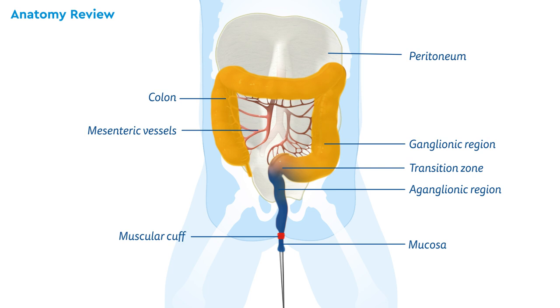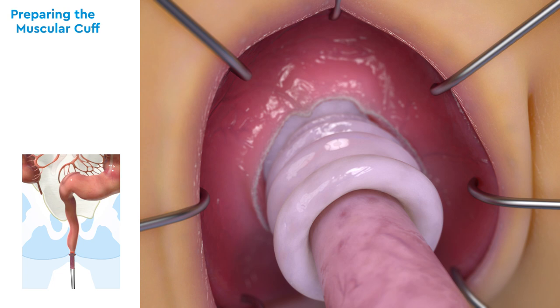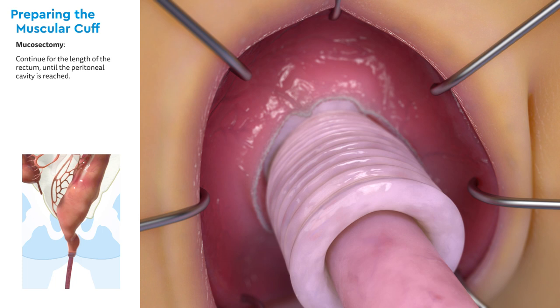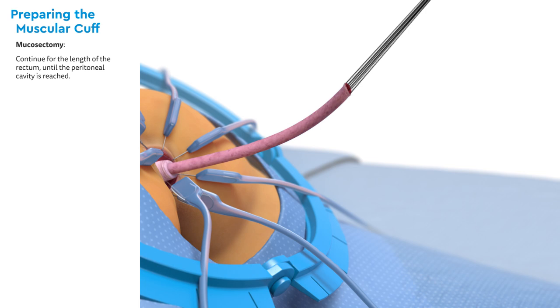At this point in the operation, the transition zone is still well inside the peritoneal cavity. The mucosectomy will continue for the length of the pelvic portion of the rectum, usually 7 centimeters, until the peritoneal cavity is identified by the peritoneal reflection. Blunt dissection must be used for the duration of the mucosectomy; this process has been sped up in this demonstration. The mucosa has now been separated from the muscularis and the muscular cuff created.